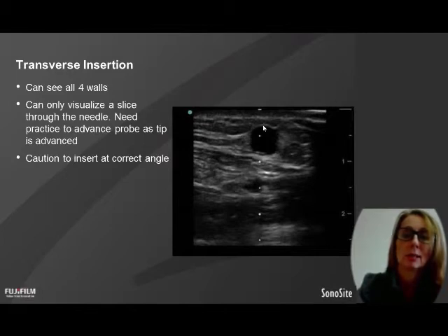If you're inserting a little bit off centre and you've got the marker the wrong way round, when you try to correct, because you see you're coming in a little bit over to the left here, you'll try to adjust to the right, but your needle will keep moving more left, and that's because you've got your marker on the wrong orientation. So remember that when you've got your probe on, move it to the left, and your vessel should move to the right, move it to the right, and your vessel should move to the left. And that way, if you come in a little bit crooked and you decide you want to straighten up to the right, it'll go right when you think it's turning right, and you won't have confusion.